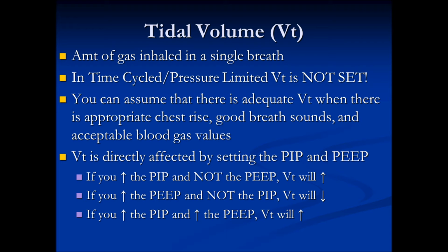If you increase your PIP, but you do not increase your PEEP, your tidal volume will go up. If you increase your PEEP, but you did not increase your PIP, then your tidal volume will go down.